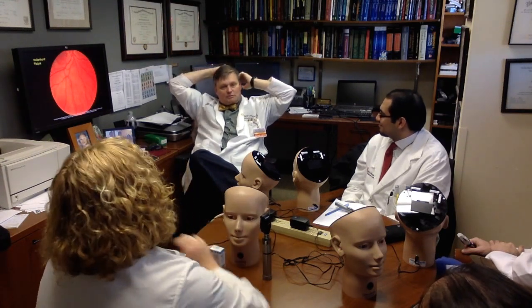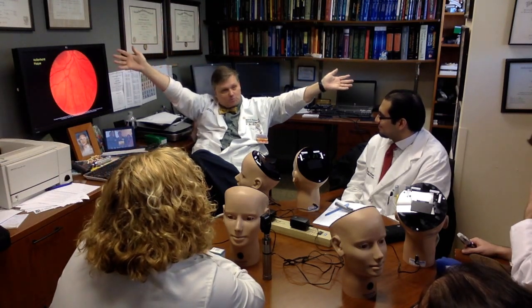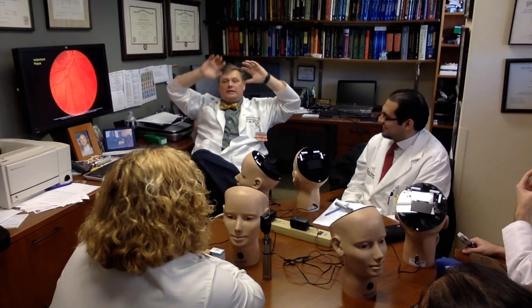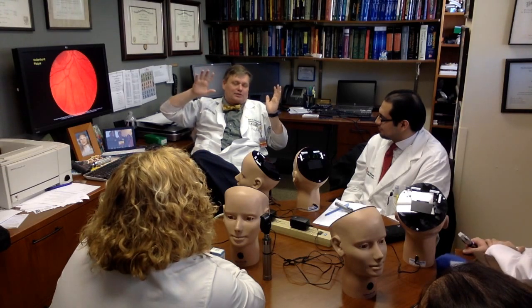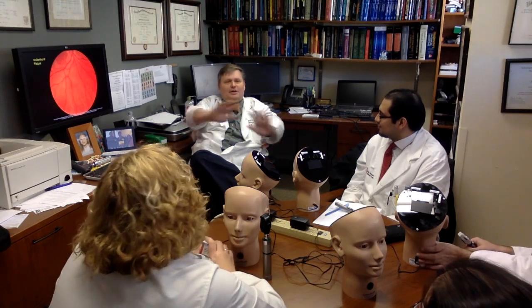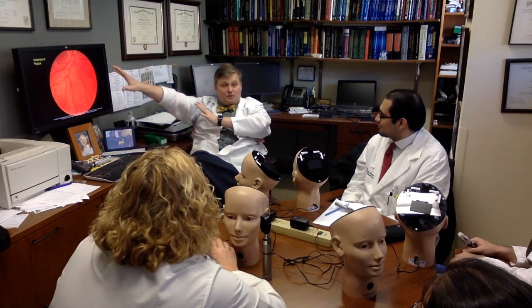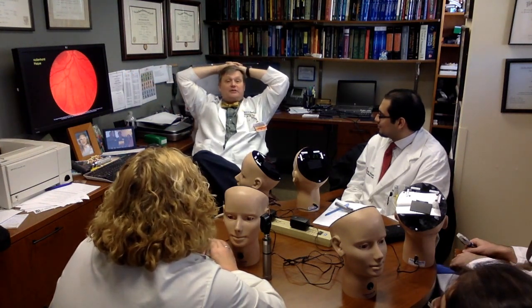So, you have to have an ophthalmoscope. It's got to work. It's got to be charged, okay? But now our program, I think we've optimized this as much as humanly possible. Everyone's got their drops. Everybody knows about the documentation stuff, right? We've done the videos. We've done the simulation. Now you've got the drops.